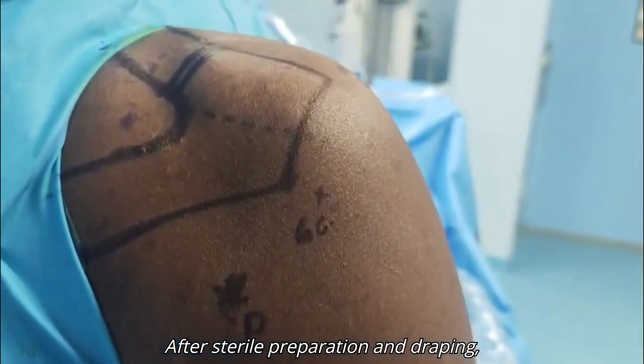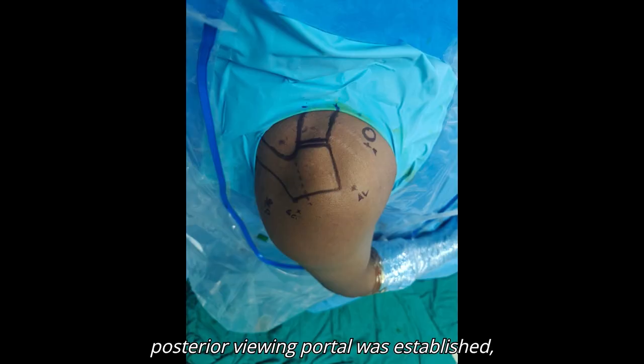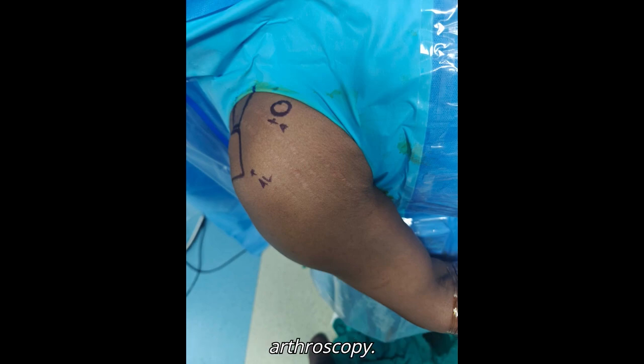After sterile preparation and draping, bony landmarks were outlined. The posterior viewing portal was established, followed by diagnostic glenohumeral joint arthroscopy.